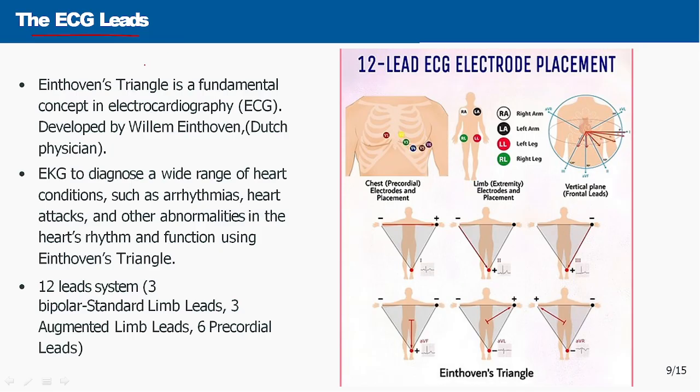We call it electrocardiograph, ECG in short form, or EKG. They have 12 leads.